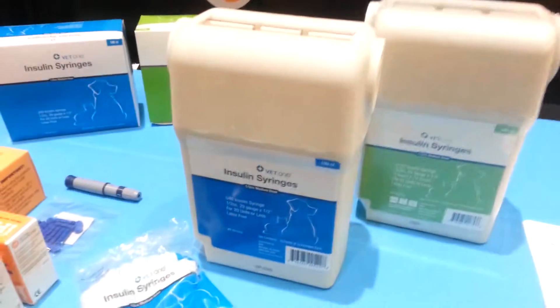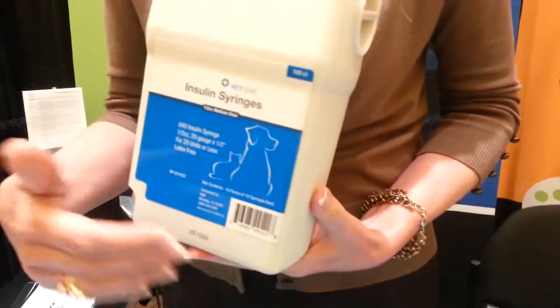We are at the WIS Shales meeting talking to Kathy from Ultimed about the VET1 insulin syringes. We manufacture insulin syringes in both the standard box, but what sets us apart from the competition is a product called the UltiGuard. It's an all-in-one dispense and dispose.